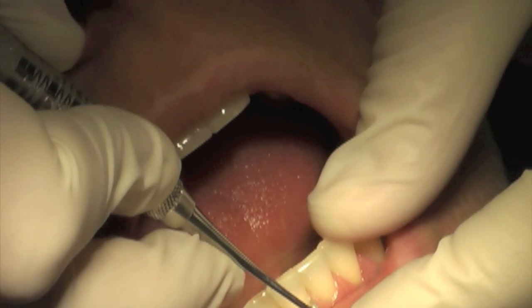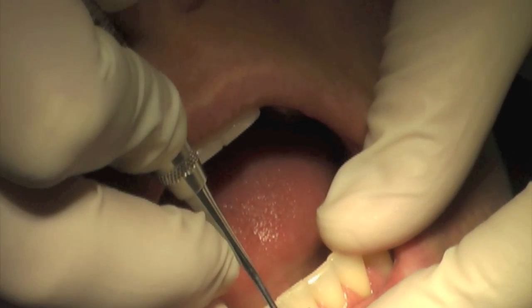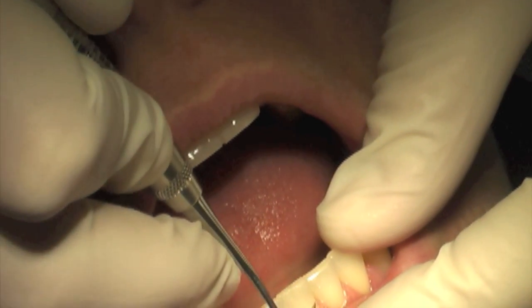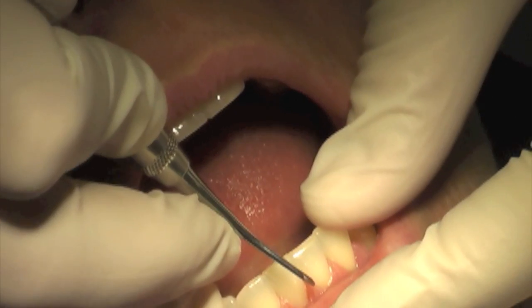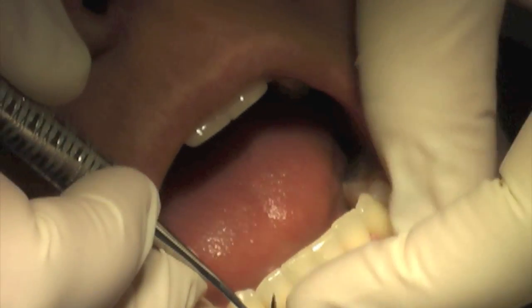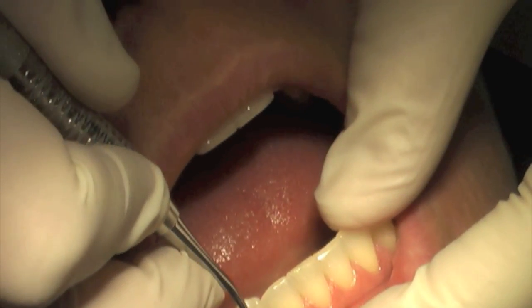See how I do that? I just keep that toe constantly, constantly connected to it. And I'm being a bit dramatic here using the facial surface of the tooth.